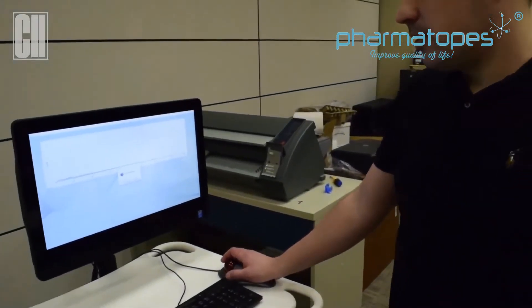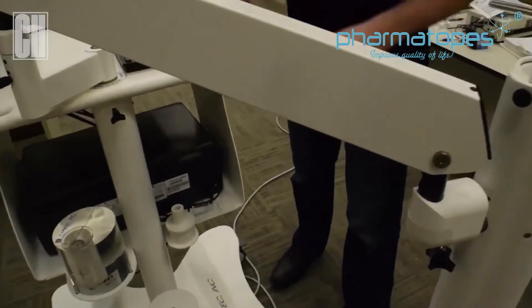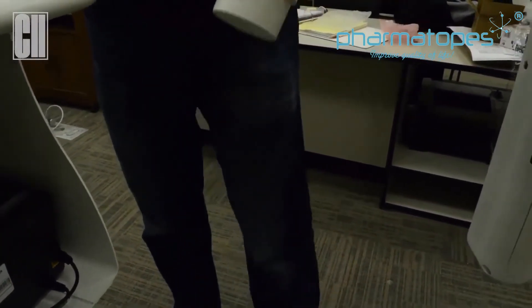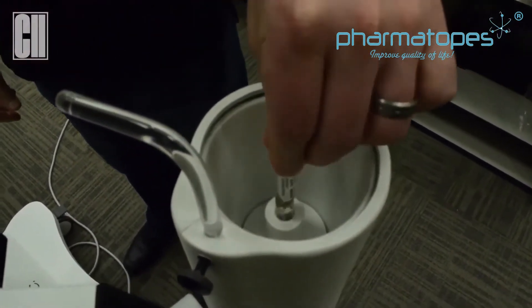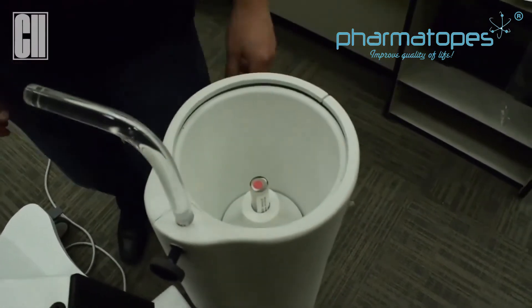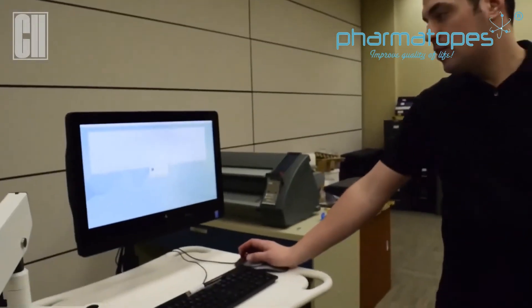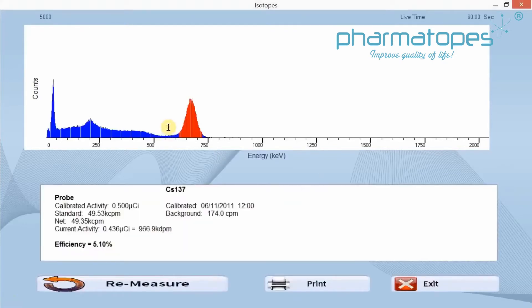After the background is completed, we're going to accept the background measurement and position the cesium in the probe. You'll need your source holder once again for the probe and place that into the probe. After we measure the cesium and accept it, we're going to get an efficiency and the result will be shown there. The result should fall into a 3.17 to 6.33 window.